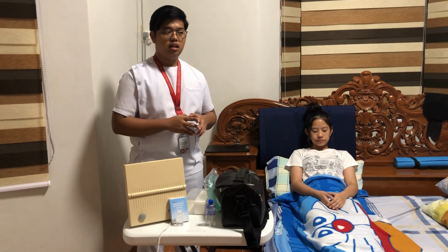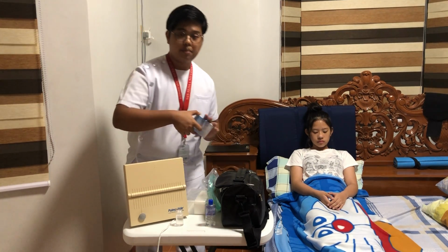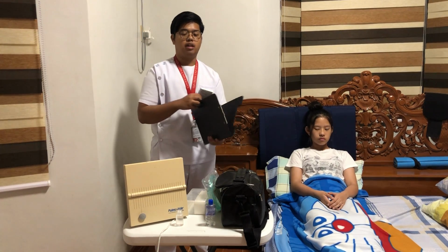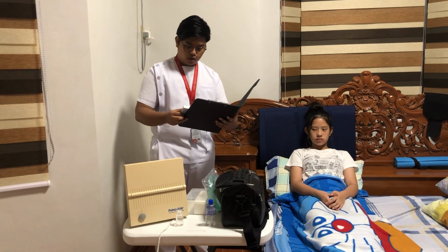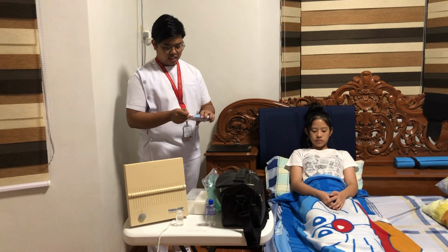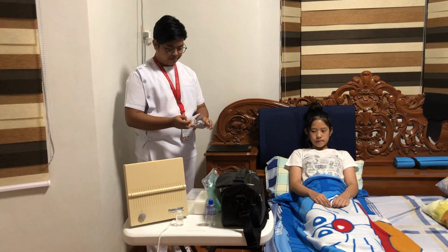And then after verifying, we need to compare the medication label to the order, which can be seen in the patient's medical record, which we have there. So we're going to compare the medication label to the order in the patient's medical record. Ipratropium salbutamol Duavent nebules. So with that, we also need to check the label, which is attached here on the nebules itself. Salbutamol Duavent.